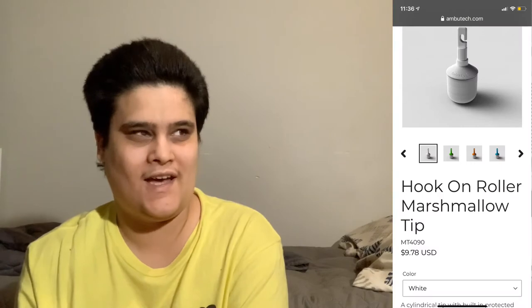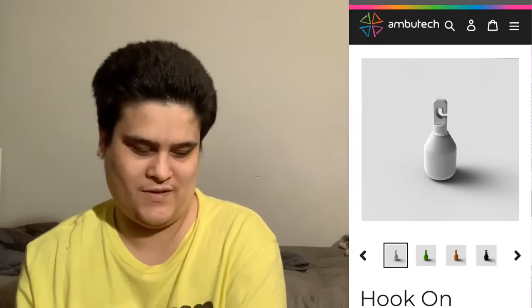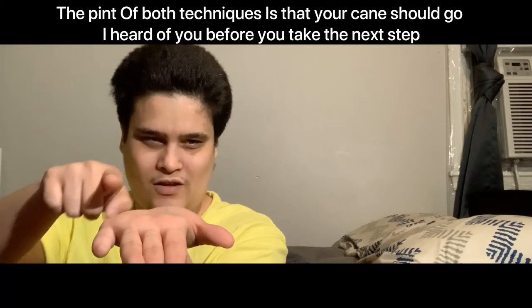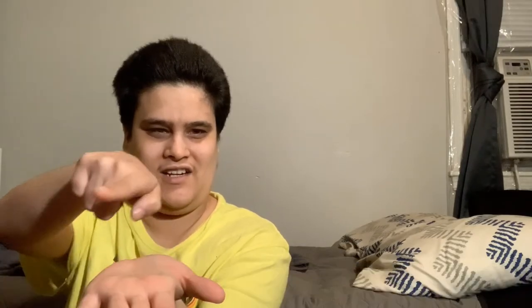I'm currently looking at a marshmallow tip. Marshmallow tips are large tips, just like the round ones, and they can be used with the two-point touch technique. The two-point touch technique is where you tap your cane from side to side on opposite parts of your body — so if I'm going to take a step this way, my cane is going to tap over here.